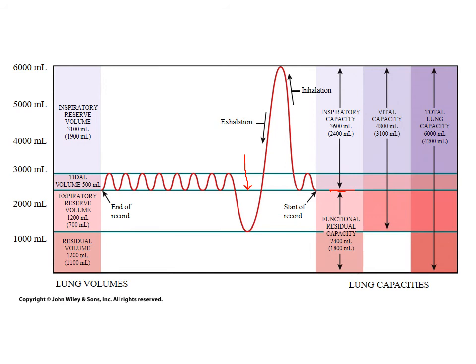If I start another respiratory cycle, before I start to breathe back down, if I was to keep breathing up, I would get up to the top where I cannot breathe anymore. And this ends up being called the inspiratory capacity.